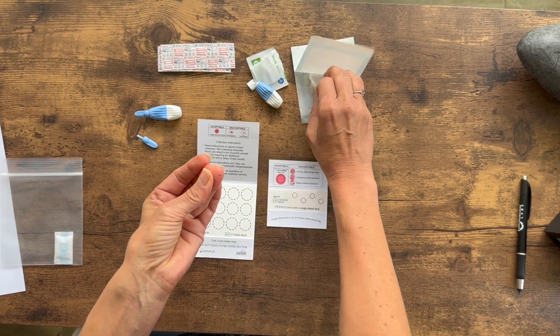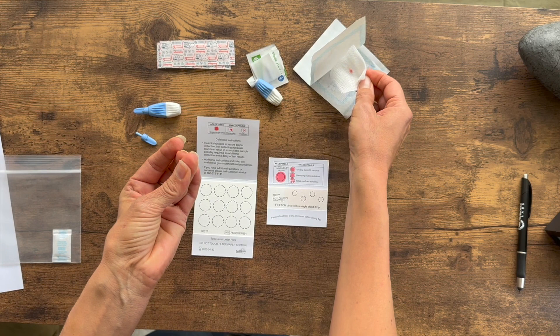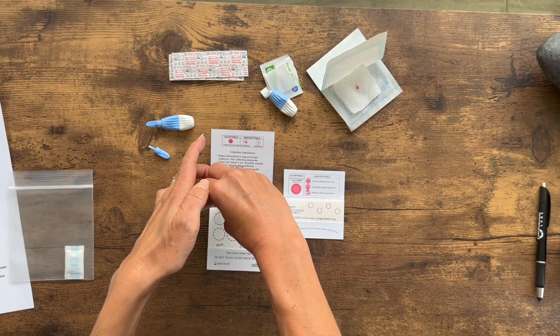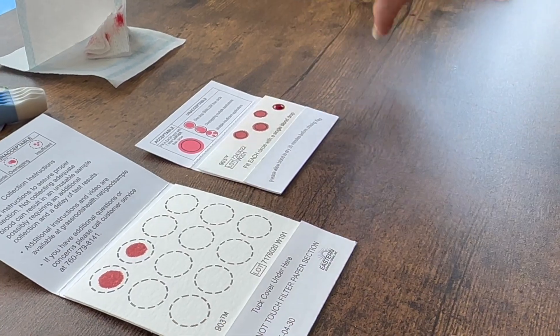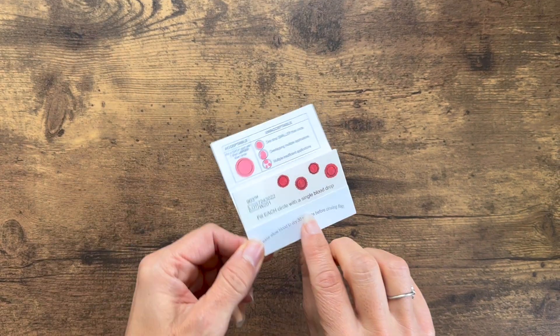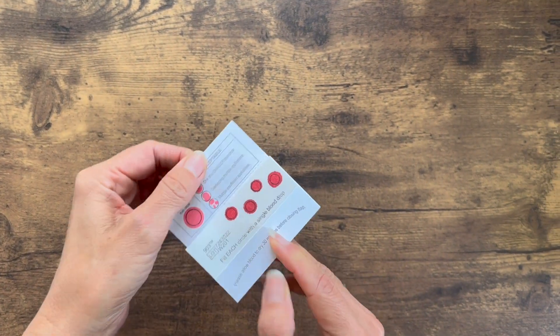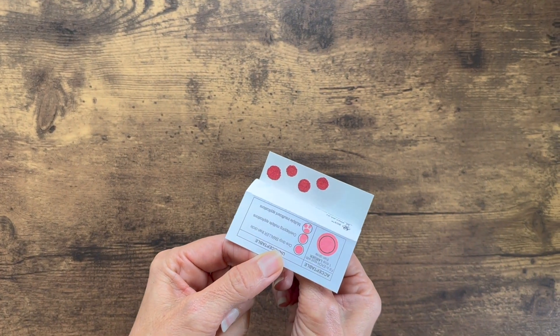Wipe the puncture with the gauze to help the blood start to flow. Let the blood well up on the fingertip before applying to the filter paper. Do not touch the filter paper with your finger. You will need blood on each of the cards provided as noted in your instructions. Make sure that the needed number of circles have drops of blood that are at least the size of a pencil eraser and soak all the way through to the back of the filter paper.